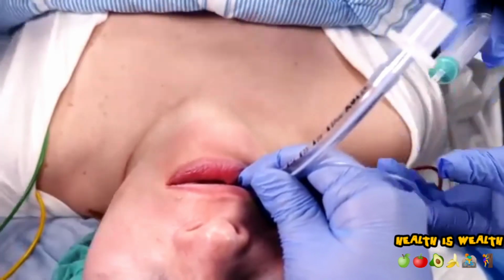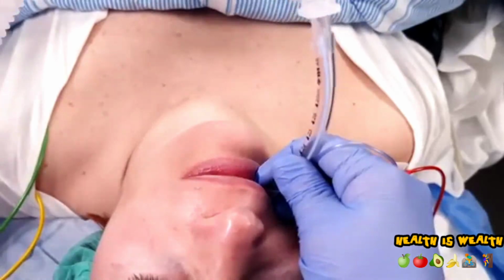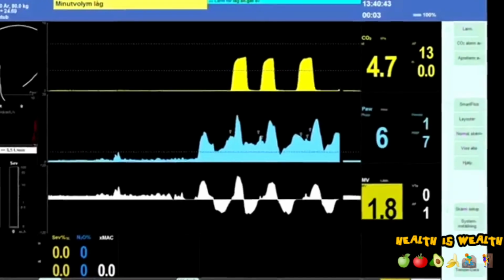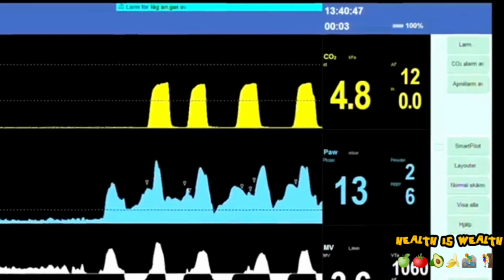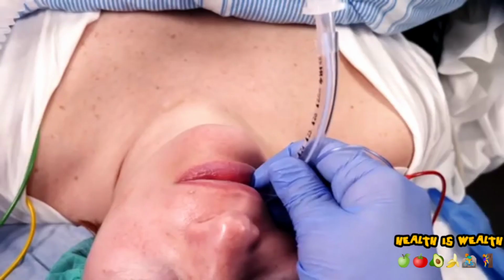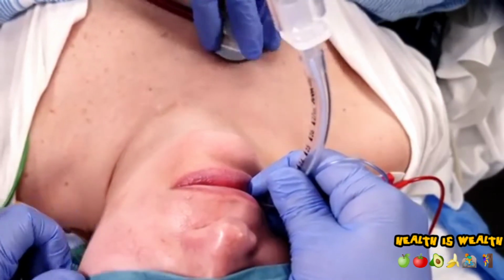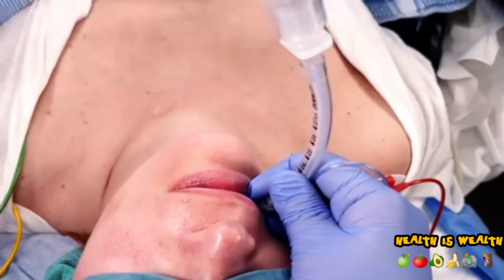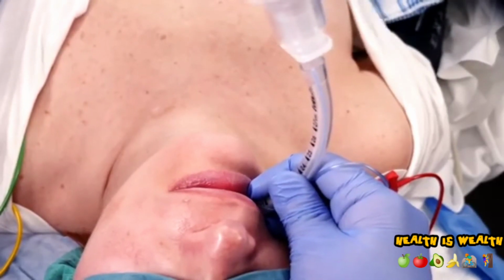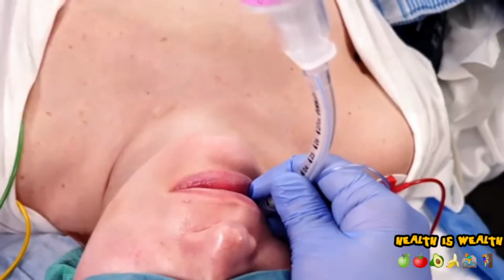Hold the tube firmly while you confirm that it's lodged in the trachea and not the esophagus. The gold standard is return of end-tidal carbon dioxide over several respiratory cycles. Be very cautious when interpreting the other signs traditionally used: auscultation finds on both lungs, condensation in the tube, and the symmetric rise of the chest wall, as these may very well be positive despite an esophageal intubation.